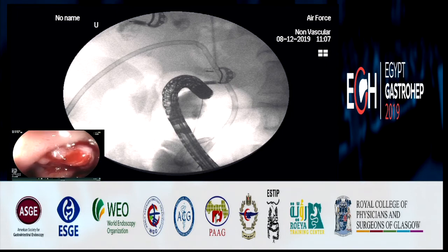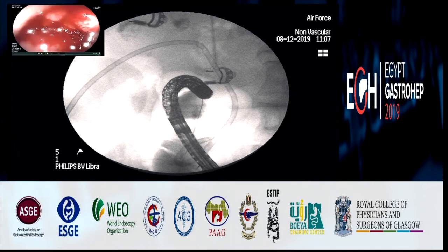Excuse me, sir. What is the diameter of the catheter you used before introducing? Normally the idea is to assume that you will have a biliary drainage before placing a duodenal stent. Sir, there is a question: what is the diameter of the catheter you used? I'm not sure that there is a question coming from the audience.